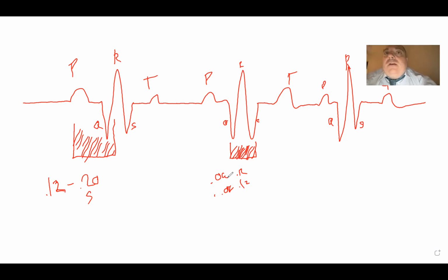that certain rhythms, whether they originate in the atrium, like as in the SA node, or they originate, we'll say, above the ventricles, maybe in the AV junction somewhere, you're going to see that those have narrow complex QRSs. But then when we see things that have wide QRS complexes, sometimes those are going to originate down in the ventricles. It gets even more complicated later on with things called bundle branch blocks, and there's other reasons with which a QRS can be wide as well. But we're not going to worry about any of that for right now. Okay, so for right now, QRS should be around 0.06, 0.08 to 0.12. If it's greater than 0.12, it's going to be wide, okay?